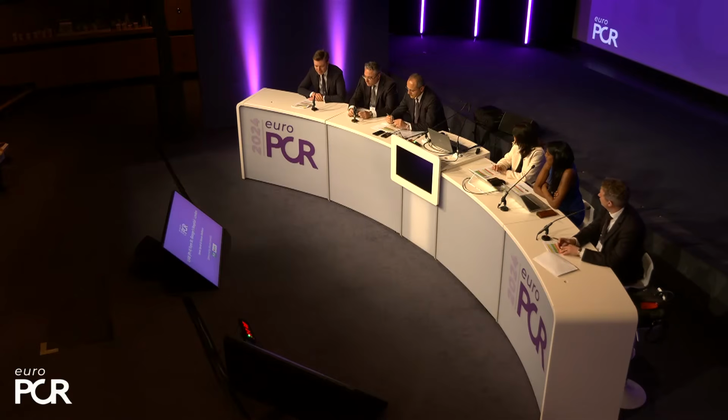What is your guess? Are we done with plaque modification now? Are we ready to stent, Dayan? So that's the big question. Can we decide whether the plaque modification was enough based on imaging, or based on the fact that an NC balloon sized to the same size that the stent will be fully expands in several projections? I think that's the main question for discussion.